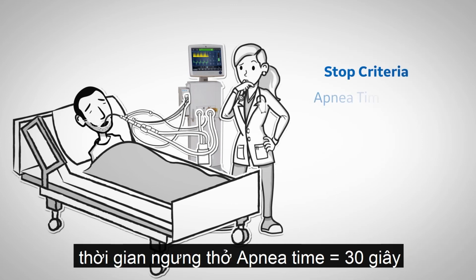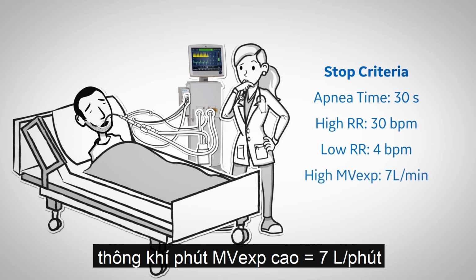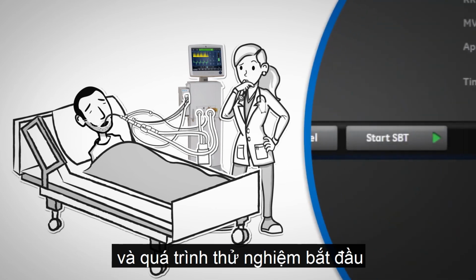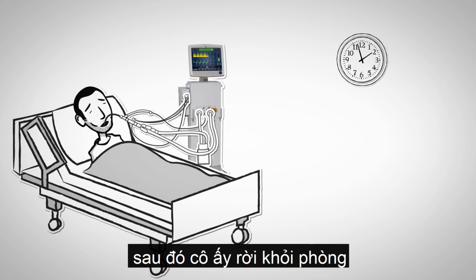Sally enters the apnea time of 30 seconds, a high respiratory rate of 30, and a low respiratory rate of 4. High expired minute volume of 7 liters per minute, and a low expired minute volume of 3 liters per minute. She then selects Start SBT and the trial begins. Sally waits for a few minutes as John begins breathing comfortably, then leaves the room.